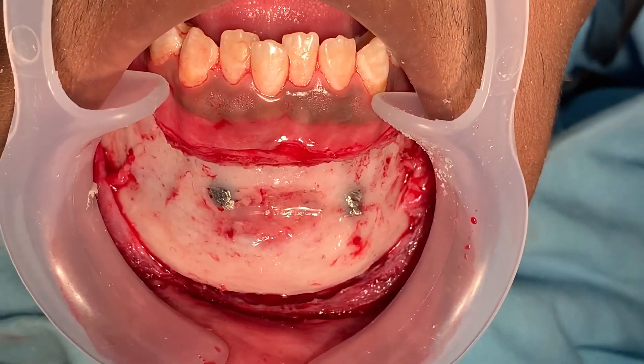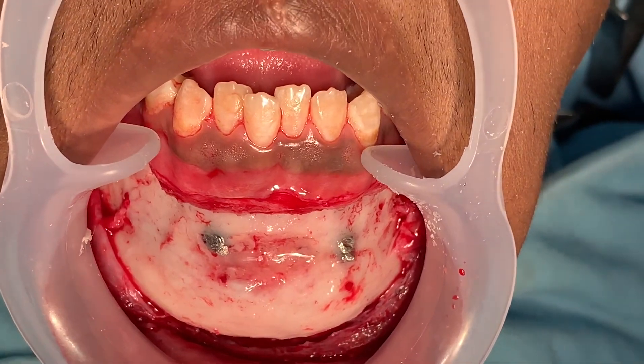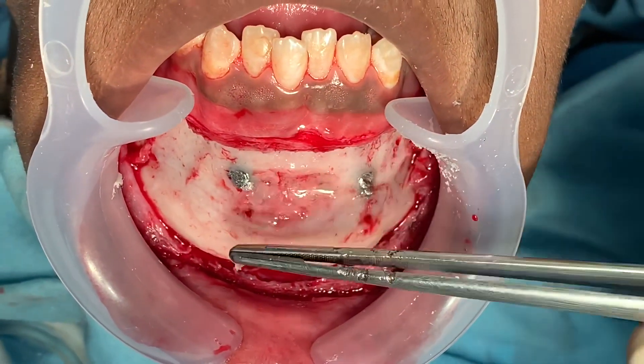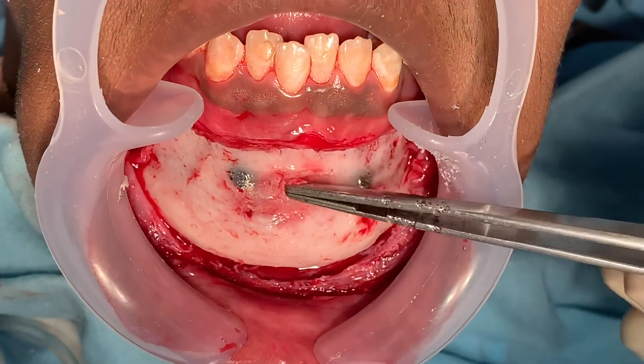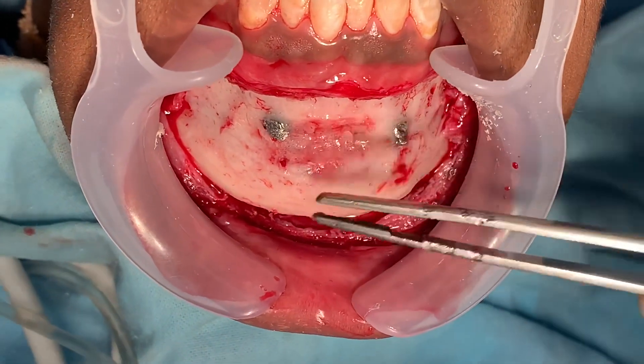I just completed this osteoplastic — I would call it a sculpting genioplasty. I've decreased the mentolabial fold. There's some bone wax here because this has gone well into the cancellous part of the mandible — it had to.